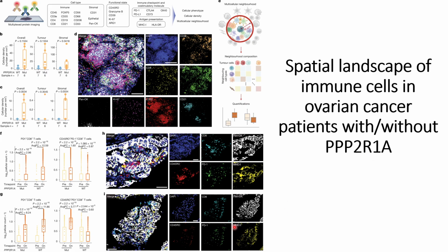We can see from the visual inspection that PD1 positive cells are low in the case where PPP2R1A is present, compared to when PPP2R1A is in mutant conditions. The PD1 amount is high in that case. This indicates that PPP2R1A somehow attracts these immune cells near the tumors, or after this treatment of the ICB, the immune cells get attracted towards the tumors and also in the stromal region.